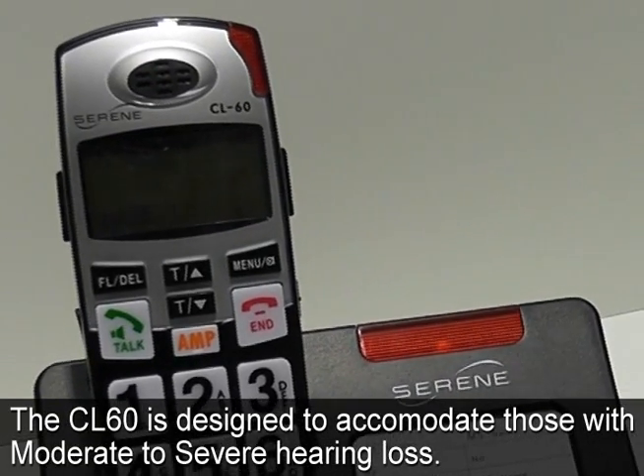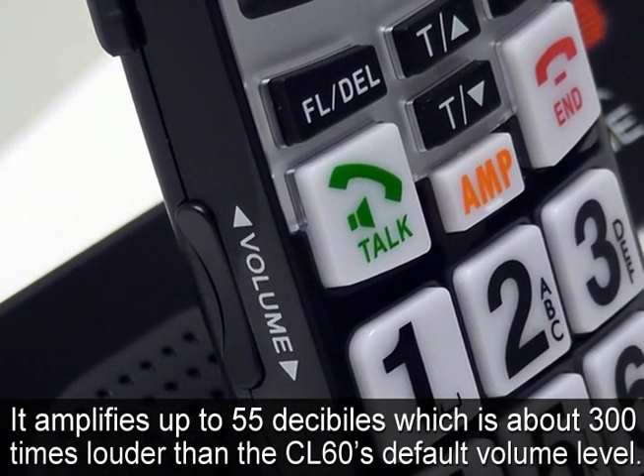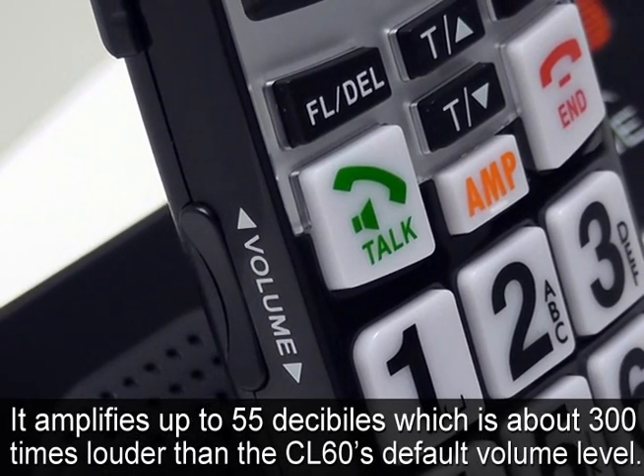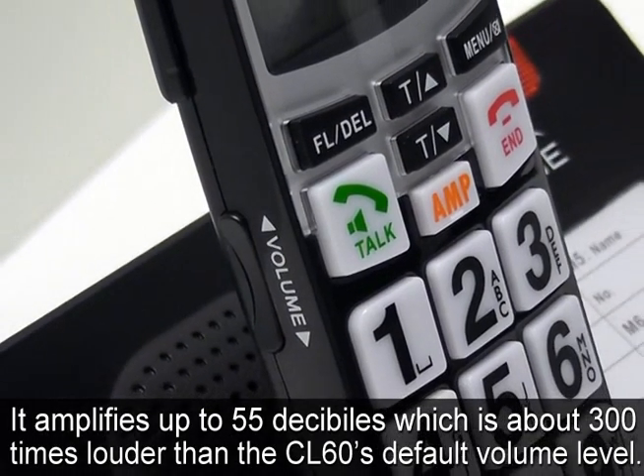The CL60 is designed to accommodate those with moderate to severe hearing loss. It amplifies up to 55 decibels, which is about 300 times louder than the CL60's default volume level.